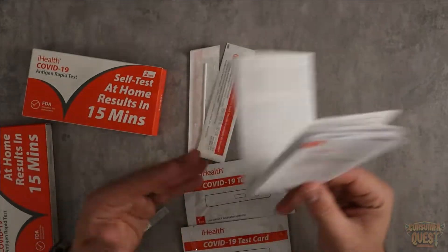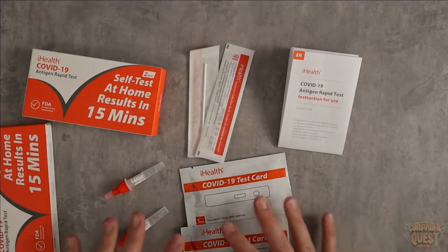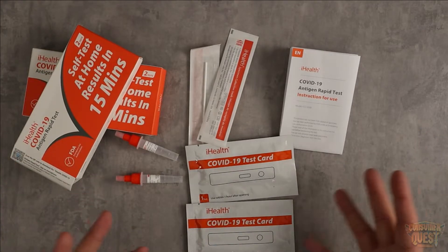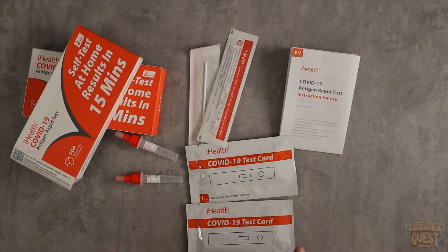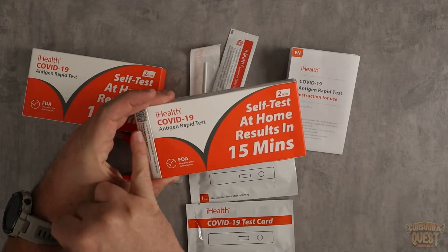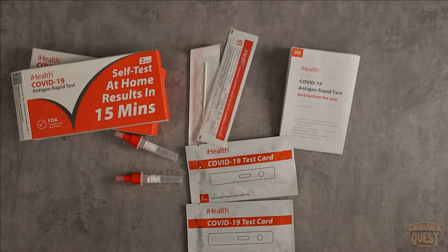It comes with the instructions and walks you right through the whole thing. You get two tests and the price was fantastic — they just arrived right at my house. If you're looking for something like this, or you've ordered some and aren't sure what it'll look like when it arrives, this is it. Anybody can do it at home, and it might help with peace of mind with everything going on with COVID. The iHealth COVID-19 rapid tests are a great option.